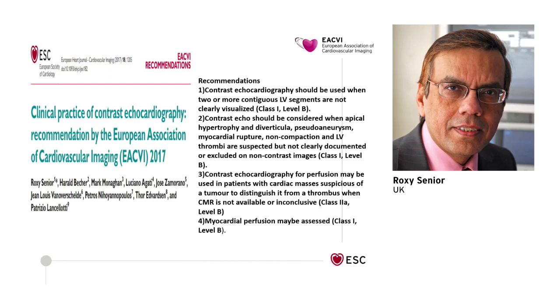So on the basis of these studies, the recent recommendation, which was published in 2017, recommended that contrast echo should be used when two or more contiguous left ventricular segments are not clearly visualized. And it should also be used where apical structural abnormality is suspected or any structural abnormality is suspected, particularly looking at LV thrombus. And this is particularly relevant in this COVID population who have a high incidence of thromboembolic phenomena, that one should use contrast to be sure that the patient doesn't have a thrombus.